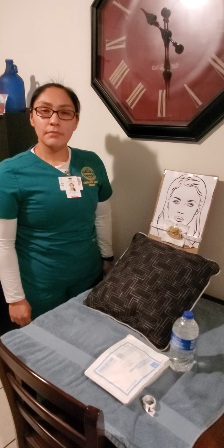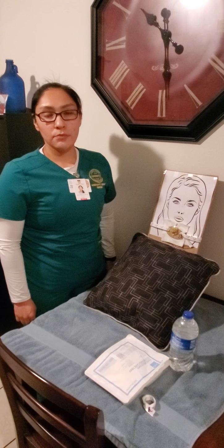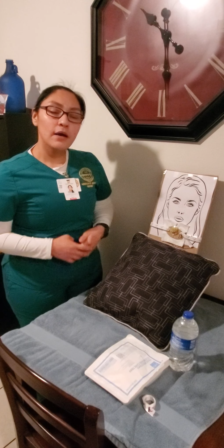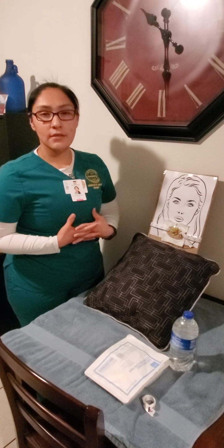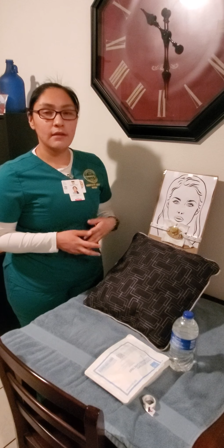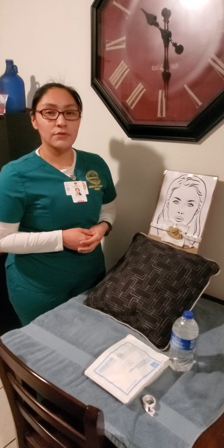Hi, my name is Alejandra Lumbreras and I'm going to be demonstrating how to perform tracheostomy care on a patient. So first I'm going to go into the patient's room, perform hand hygiene, identify myself, verify the patient identification, explain the procedure to the patient, and then I'll follow to assist the patient into a high Fowler's position.